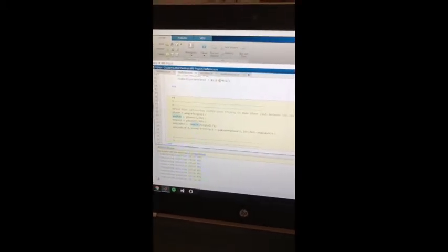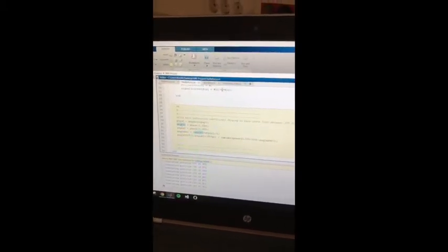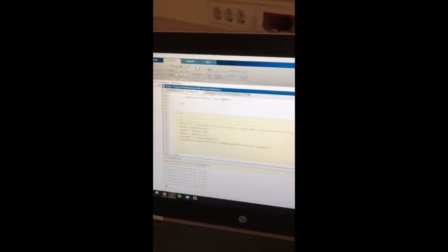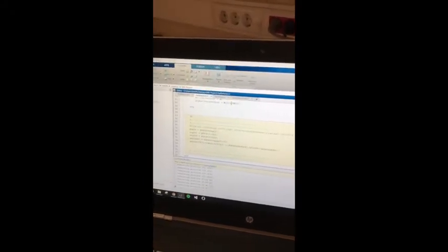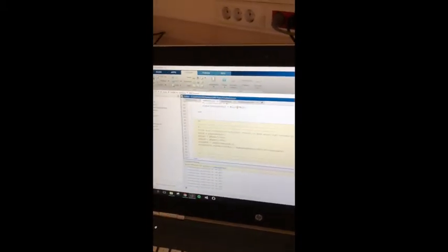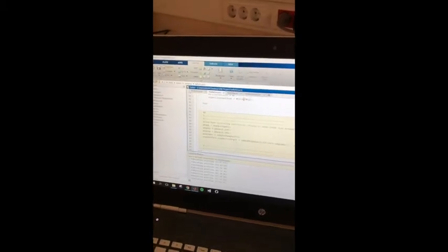What I do is I find the phase of the signal. I take the point from the index at 100 and I take a second value from the index at 300. These values are inside the max values, so I can flatten the line between them. I find the average angle between these 2 points and I take the difference of the angles for all the values between these 2 points.